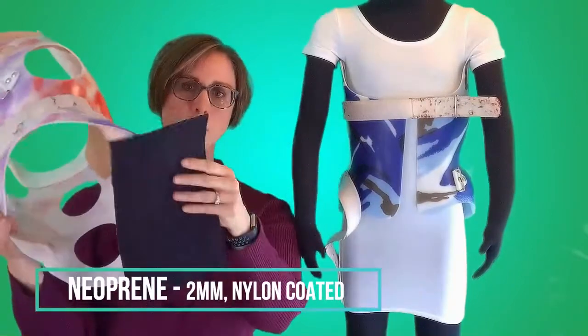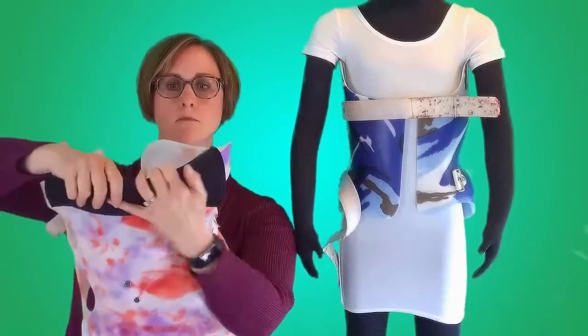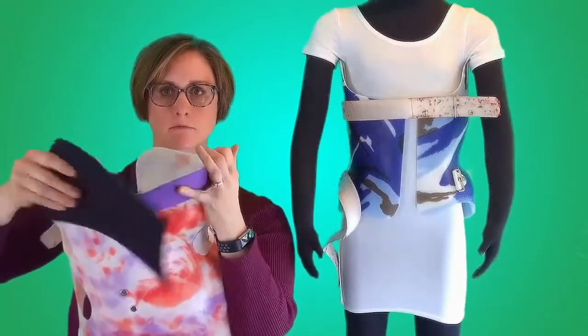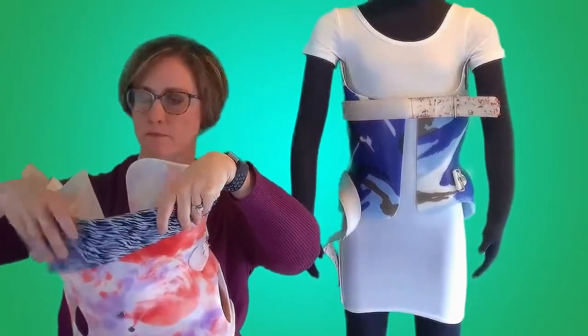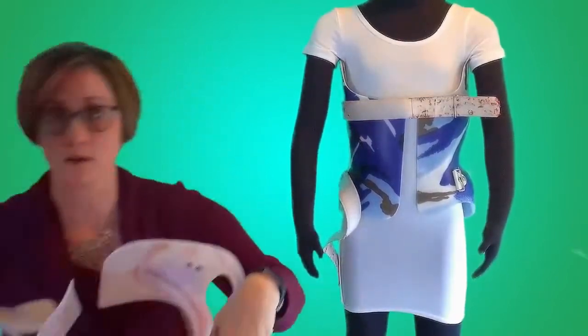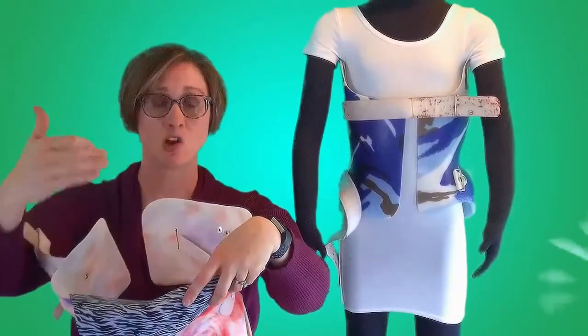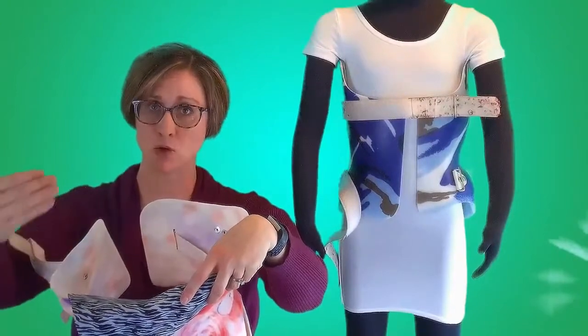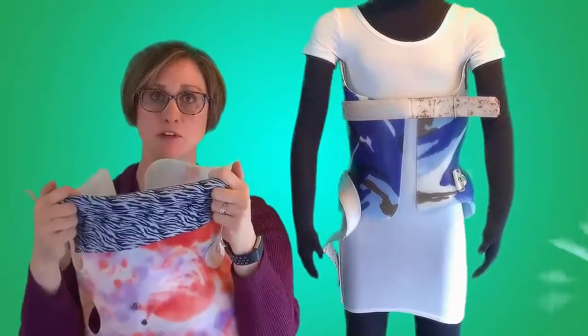Something else I have done with my children's braces when we weren't able to get to their orthotist to have it covered in Aliplast: I would take a thin neoprene and apply it over the edge of the brace. You can get patterns and colors, and then I would use a duct tape — I like Gorilla Tape, it's very strong — however you can get many different colors and patterns that your children may enjoy, and use that to adhere this piece of material over the edge.